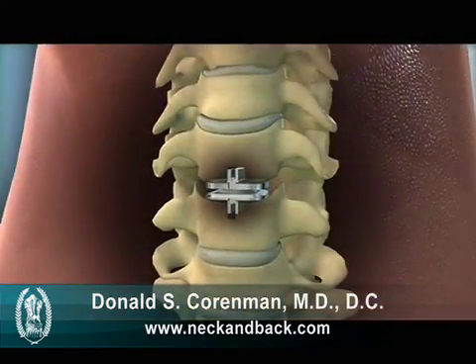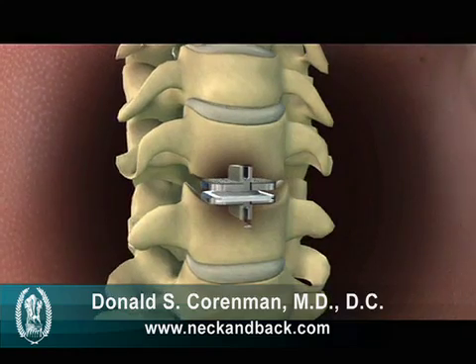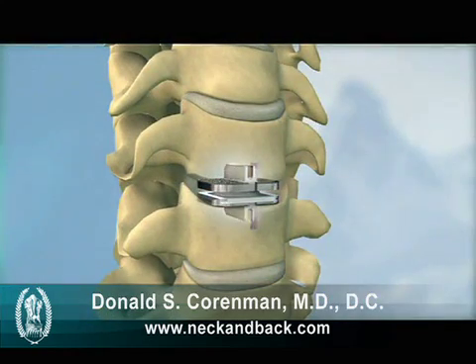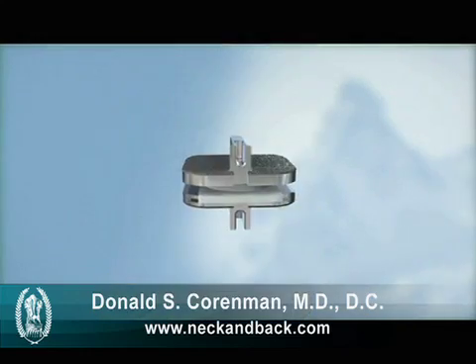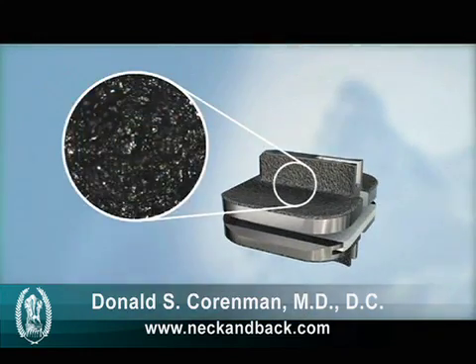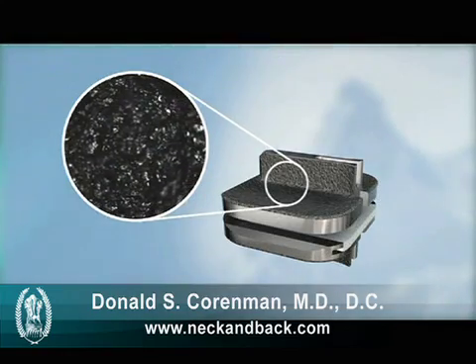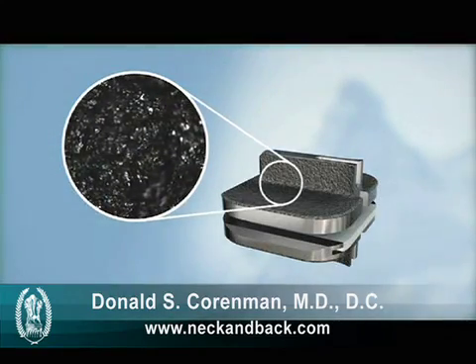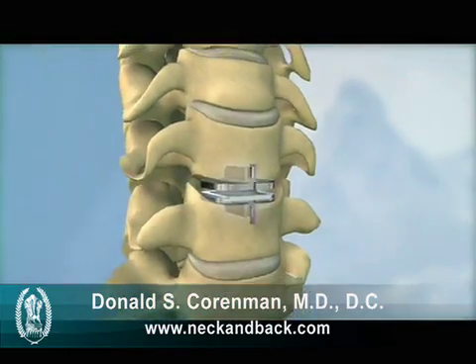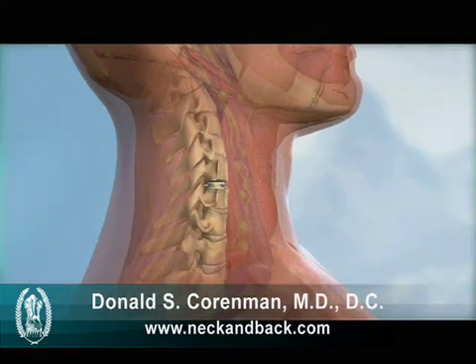The ProDiscC implant is secured to the vertebral bodies above and below the disc space and held in place with two central keels. All bone-contacting surfaces have a plasma sprayed titanium coating to promote bony ongrowth, providing long-term implant stability. The ProDiscC is a zero profile implant that does not contact soft tissue structures after it is implanted.